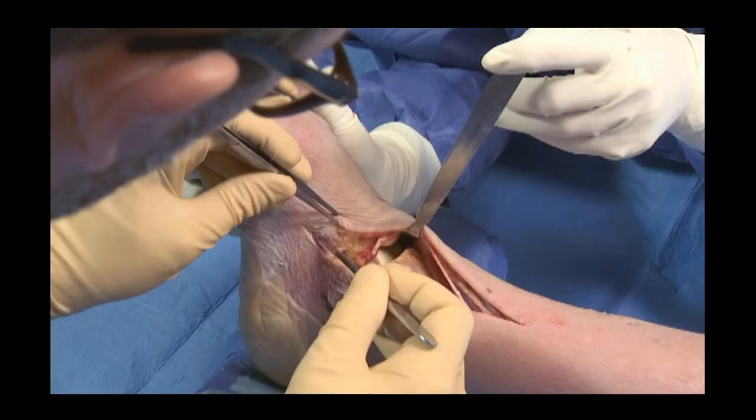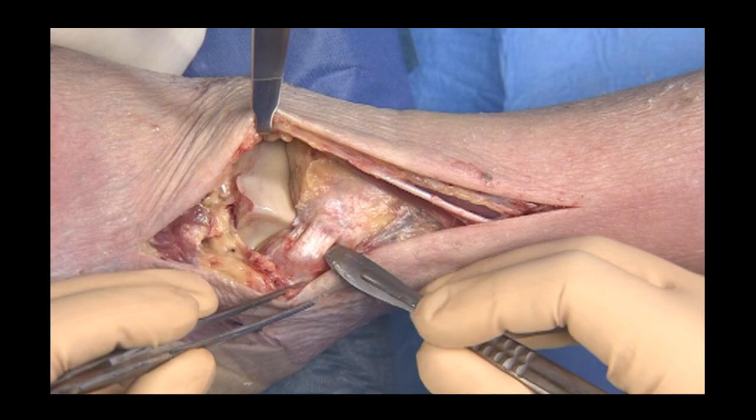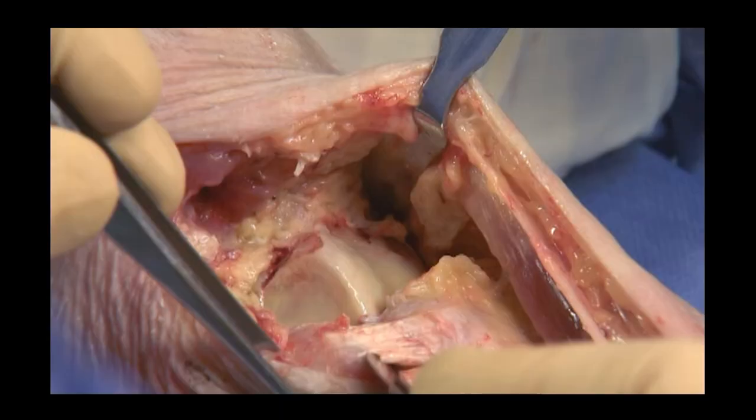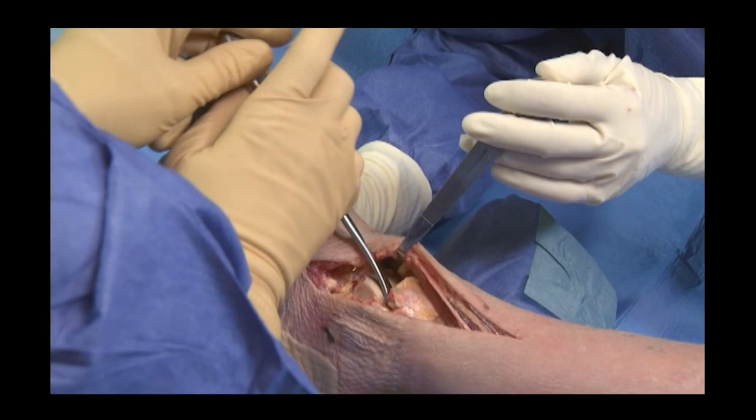A transverse arthrotomy is performed that allows mobilization of both the capsule and the extensor digitorum brevis muscle in a single flap. The anterior tibiofibular ligament is resected and the ankle joint is released with a large periosteal elevator.